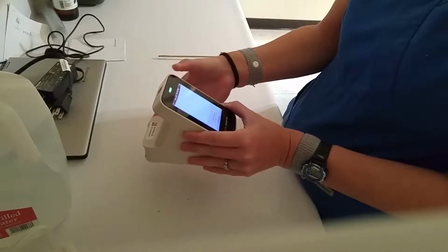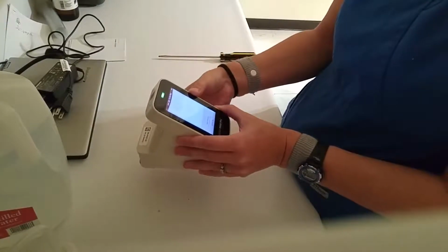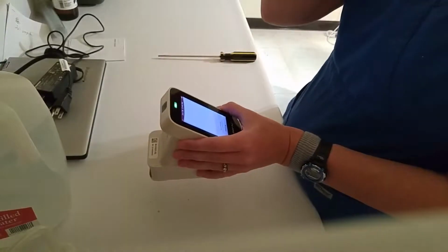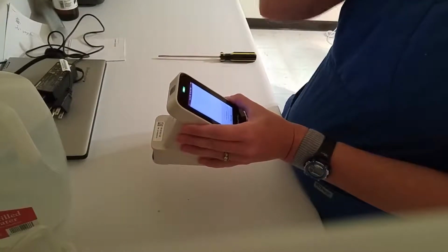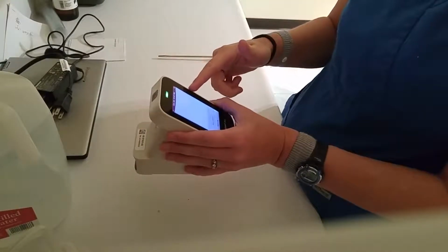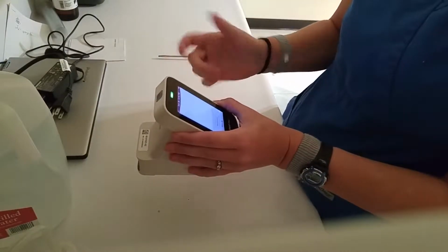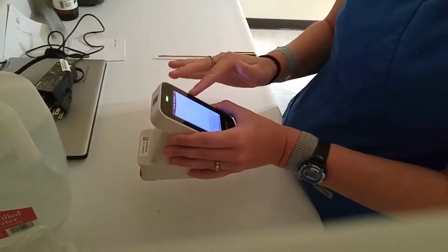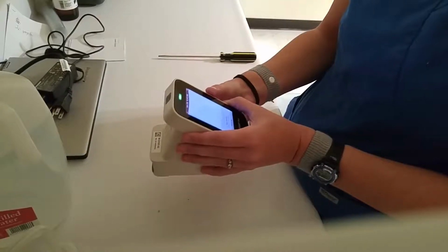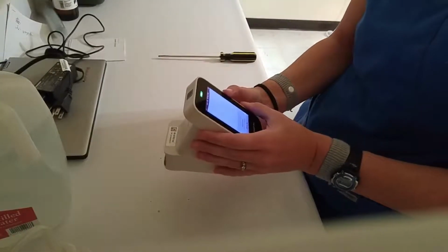Green light. The screen is clear, so we don't have any pending heartworm tests or any combo tests at all, which is important to know. Sometimes it doesn't always get deleted in this machine, even if it gets put in the computer. So we want to make sure that that's clear, just to keep it from getting built up. And then that's about it.